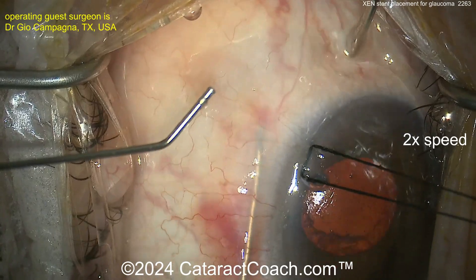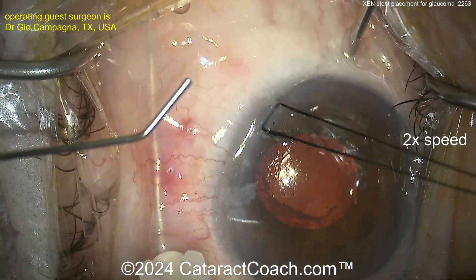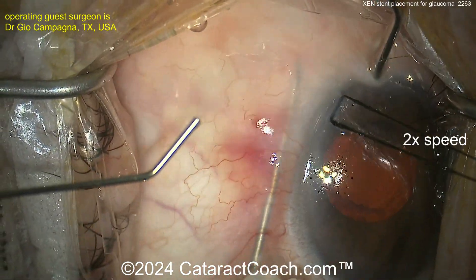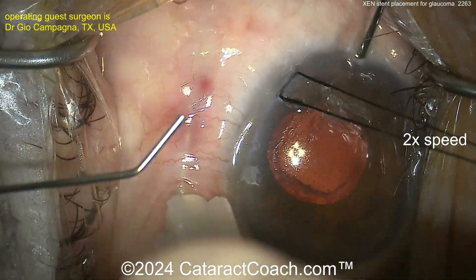Once the Tenon's sweep is done, you're basically done with the case. You can definitely use mitomycin C on these cases — it helps. In this case we're going to put some in as well. Usually a good dose is on the smaller side, so 40 micrograms of mitomycin C.